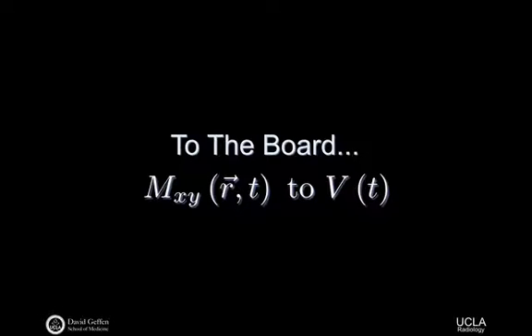So we go back to thinking about our transverse magnetization itself. We haven't seen this exact expression before, but the transverse magnetization, MXY, as a function of time, right? It depends on a bunch of things. It depends on some initial condition, so we call this MXY naught. And what I mean by the initial condition here is things like the spin echo, right? Or the gradient echo. And then that, of course, depends on TEs and TRs and things like that. So it really means what's the state of the magnetization when I want to begin actually measuring and sampling it, for example. Now, even during the process of measuring and sampling the signal, it has the potential to decay.